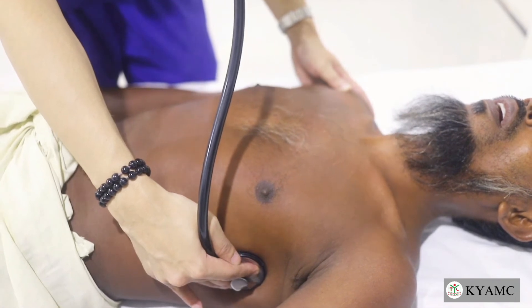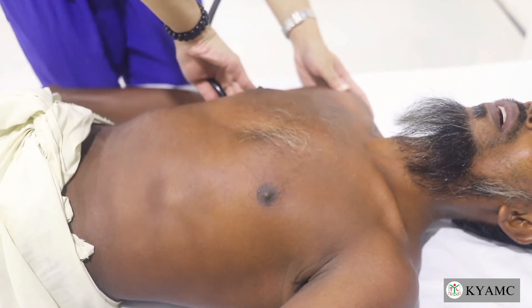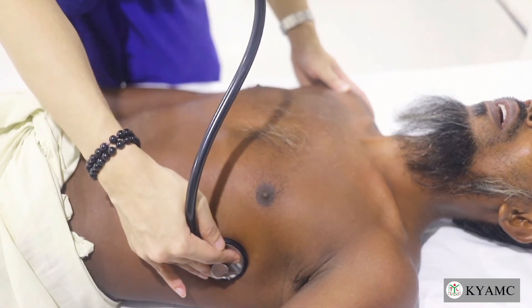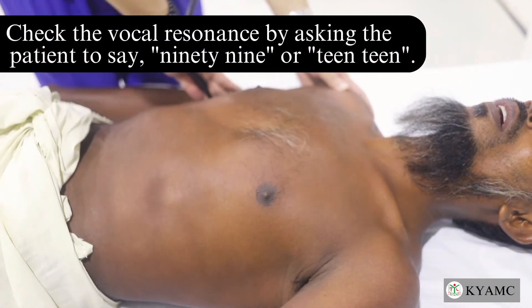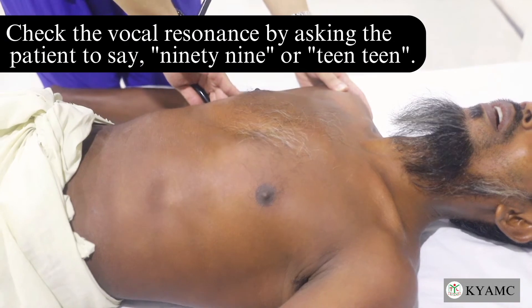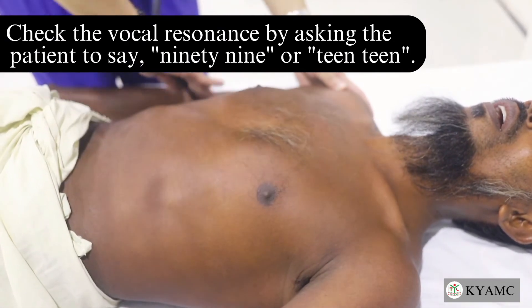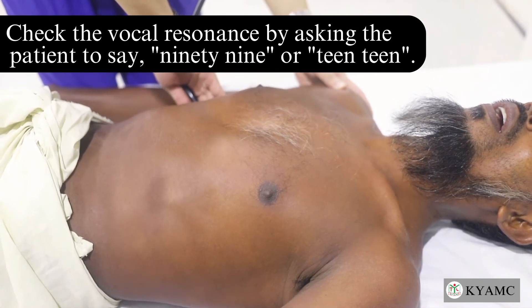Make sure to check along the mid-axillary line as well. Lastly, you may also assess the vocal resonance in the same fashion after instructing the patient to say 99 or teen teen.